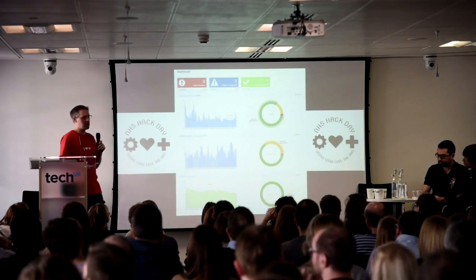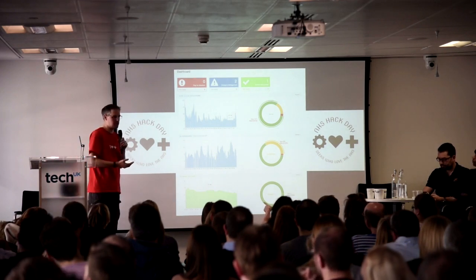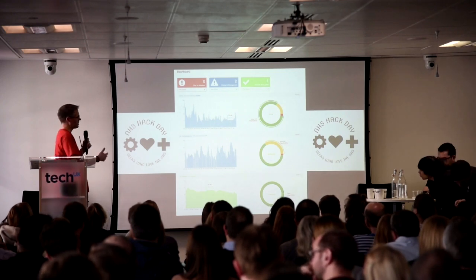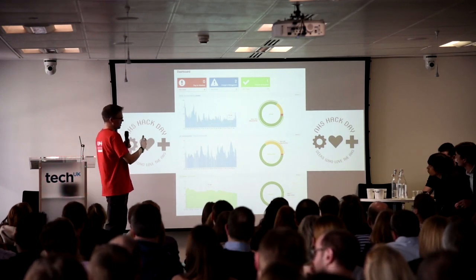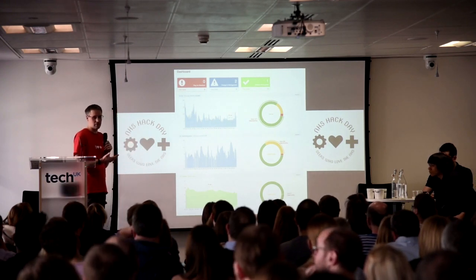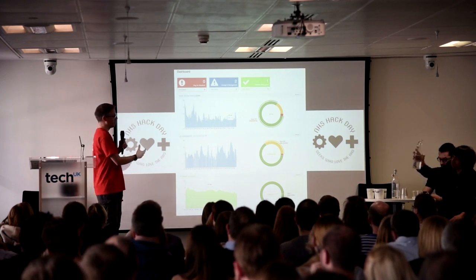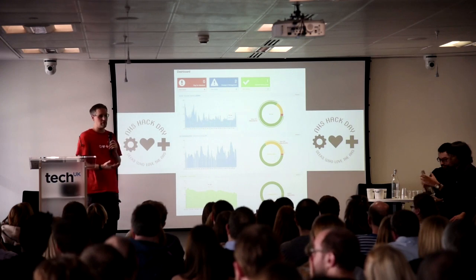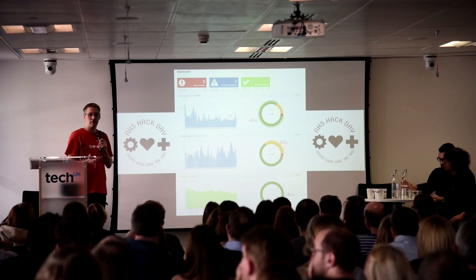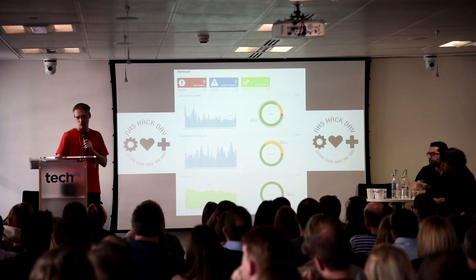So my journey hasn't stopped there. A few weeks ago, I was over in Cardiff at an NHS Hack Day. We looked at putting together Nightscout data from across the clinic into a common standard, something the NHS is used to dealing with, the HL7 standard, basically presenting a dashboard for a clinical team, helping, we hope, clinicians to reconnect with their patients' data, and through that with their patients themselves, closing that clinical loop.